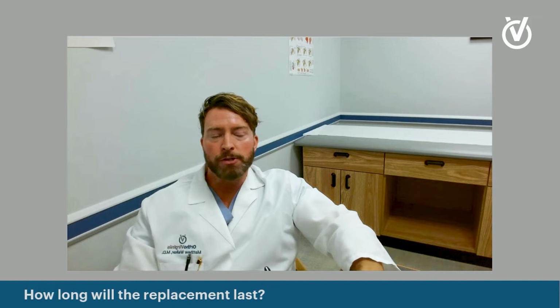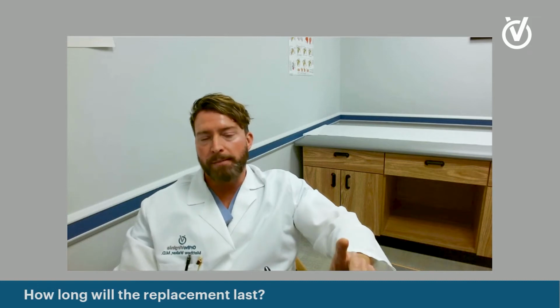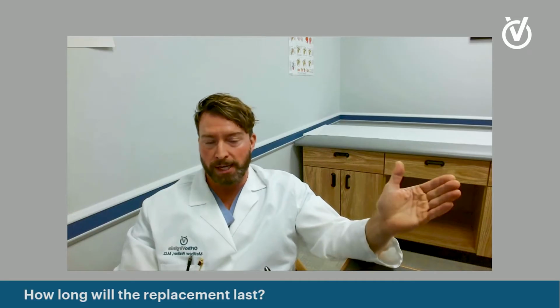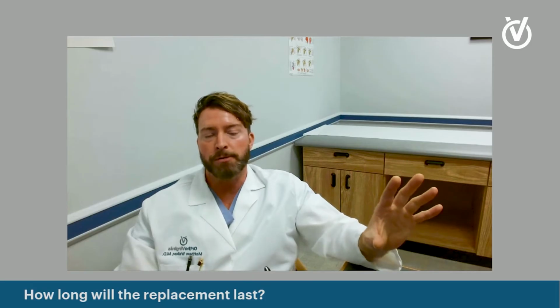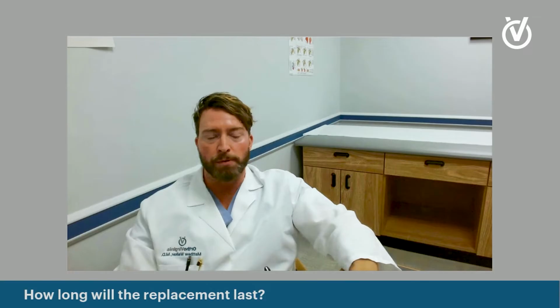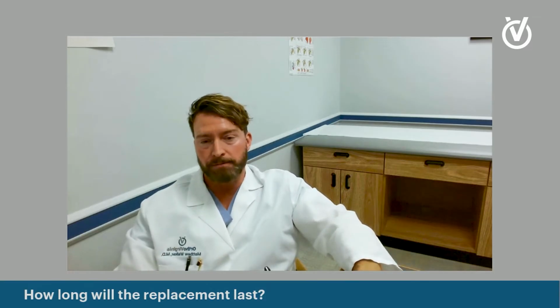And the rate of revision for shoulder replacements is 1% per year. What that means is that 1% of shoulder replacements we put in will be revised every single year. So 20 years from now, 80% of the replacements we put in today will still be in place. So in general, you can think of a shoulder replacement lasting 20 years. But a lot of times they last quite a bit longer.